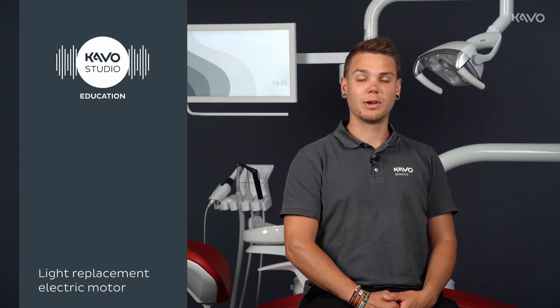Hello, my name is Sven Herzig and I am a Campus Chinite CAVO. I would like to show you how to easily replace the light source on your micromotor yourself.